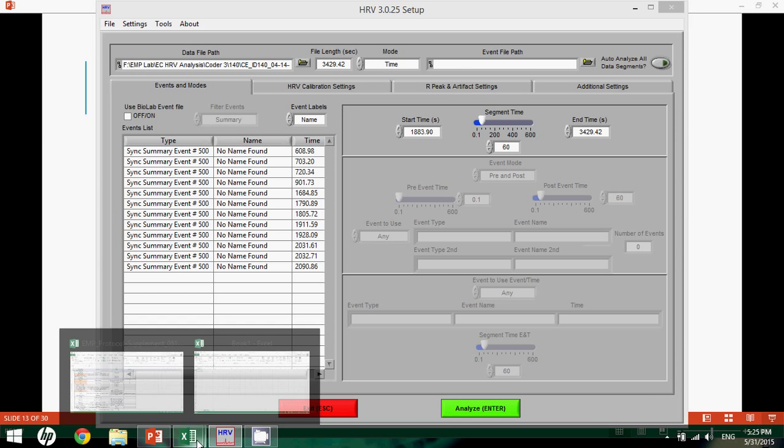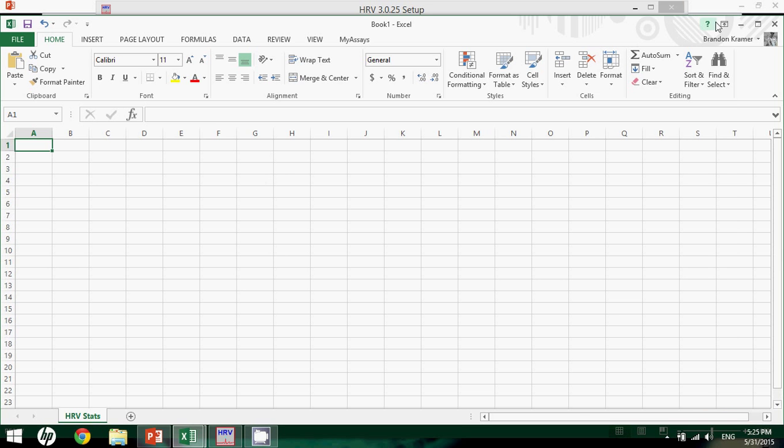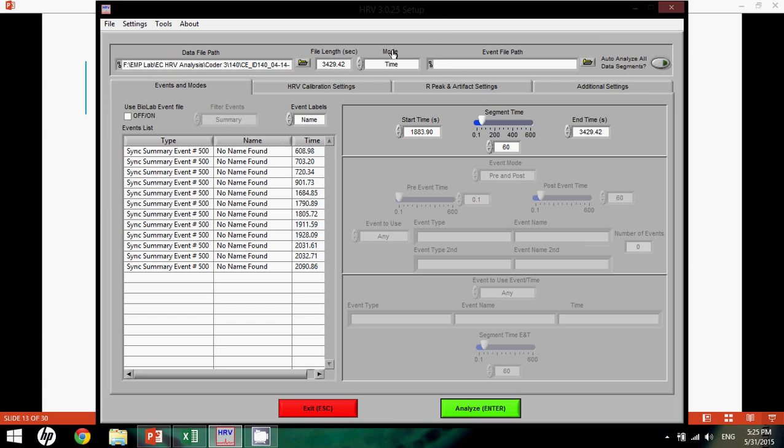Okay. In fact, you'll see here that, nope, that did not work. Anyways, so that covers everything that you'll need except for this one last feature. And this, again, won't work necessarily with the process that I'm showing you because I do not have the newest version of Excel. Basically, what this feature allows you to do is auto-analyze all of them. So rather than going through every single segment as I just showed you, I outputted only one segment. You'll see that that's actually a process that you can do completely automated.